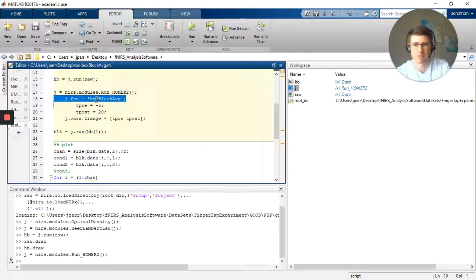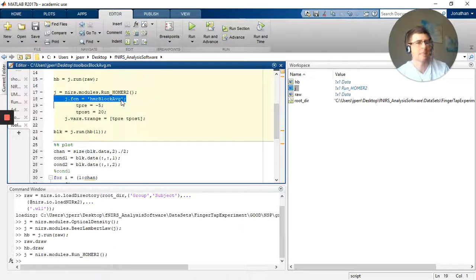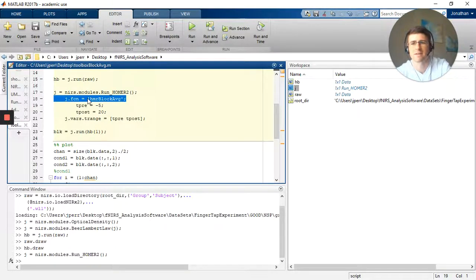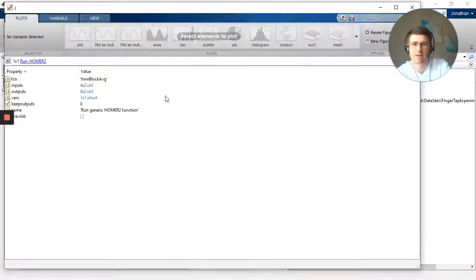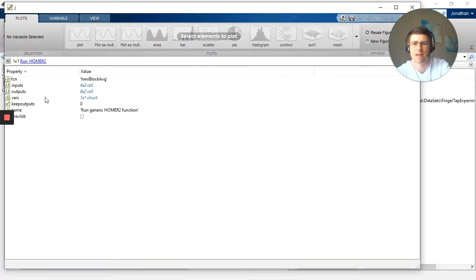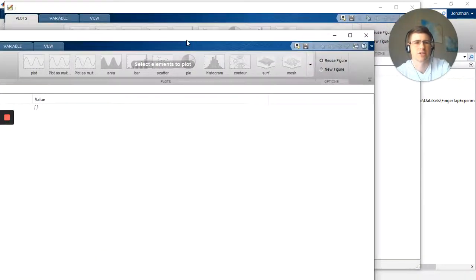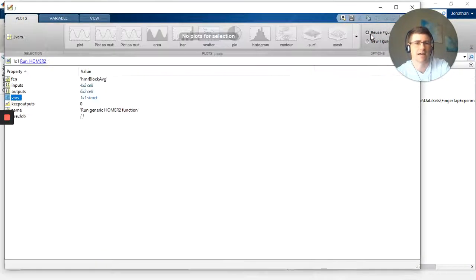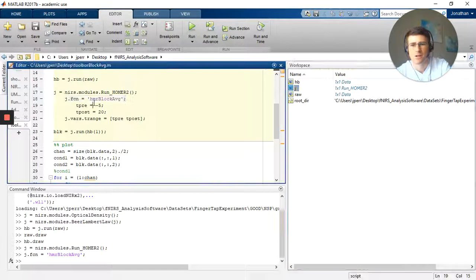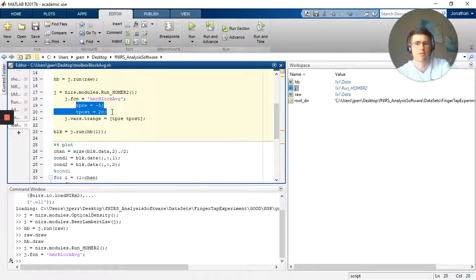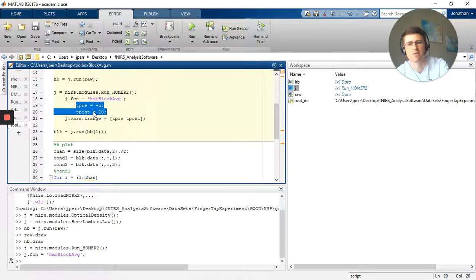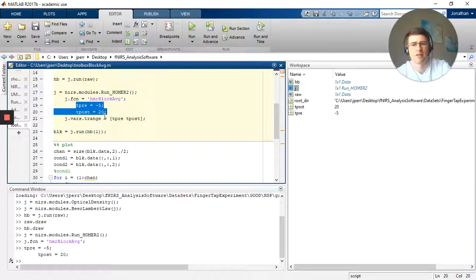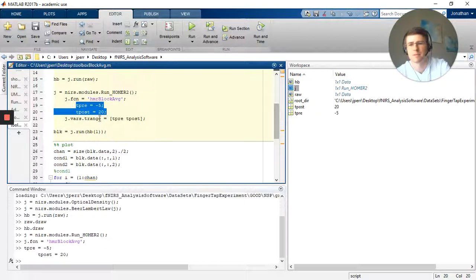So I'm going to designate hmrBlockAvg. This does have to be spelled right and capitalized correctly in order to call it correctly. So I'll go ahead and evaluate it, and you'll notice when I open this up it now says hmrBlockAvg, and now my variables have something. It's called trange and it's empty. Trange is what is the time range that you're going to do these blocks on. So I'm going to designate two variables, tpre and tpost. That means time pre-stimulus and time post-stimulus. I'm going to evaluate it and now I have a nice little array here, or excuse me, two variables with time points.